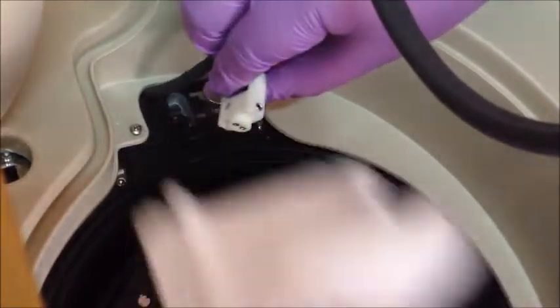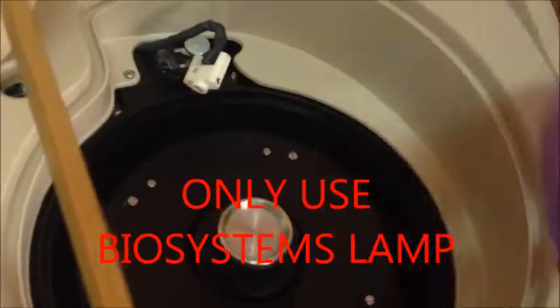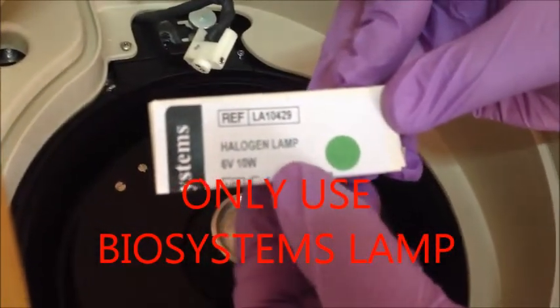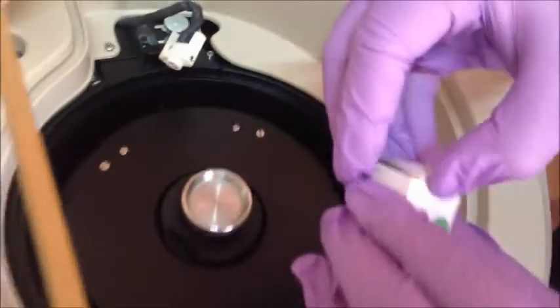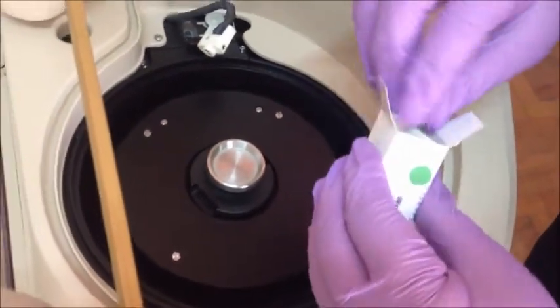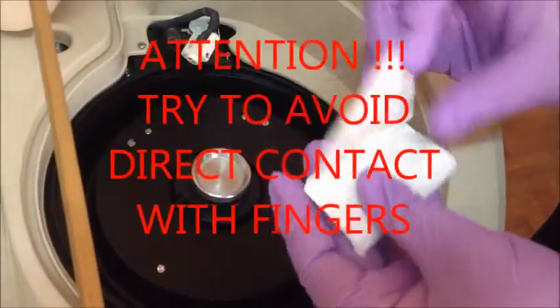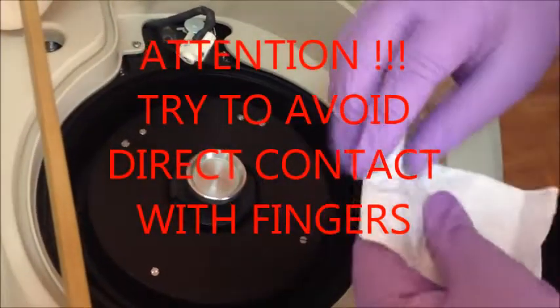When replacing with a new lamp, use only the Biosystems lamp for this analyzer. Also, avoid direct contact with the lamp lens or the lamp itself with your fingers.